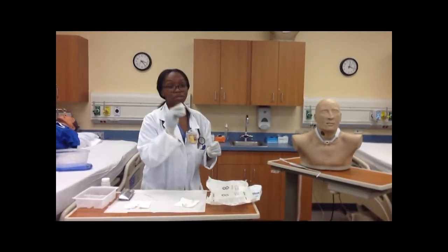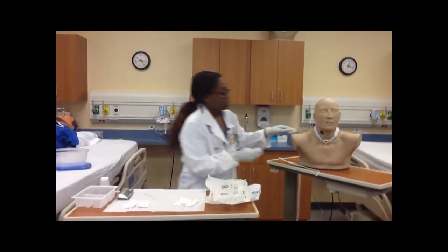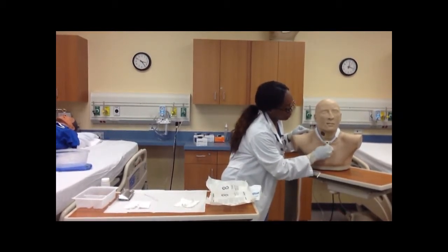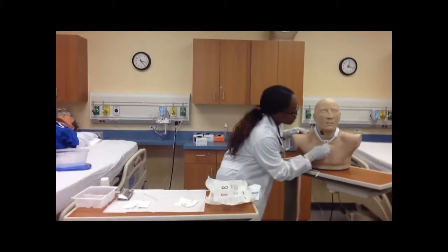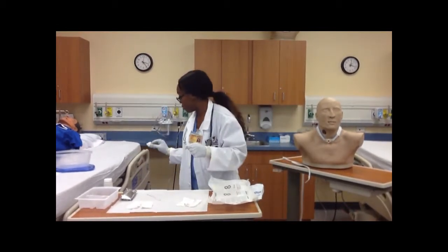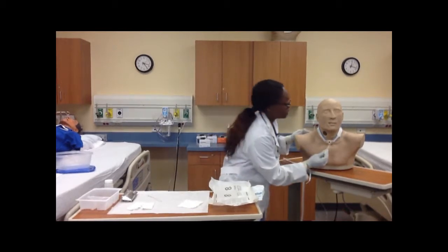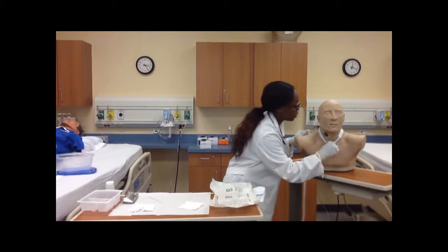Now I'm just going to make sure everything's all clean, and I'll follow up with this gauze into the saline water. I just want to clean around the patient, and like I said, it's to prevent any breakdown. I dip it in the last one, squeeze out excess water, and clean it again. And I throw this away. So now my inner cannula should be dry and I can place it back into the patient. And make sure you turn it until it locks.